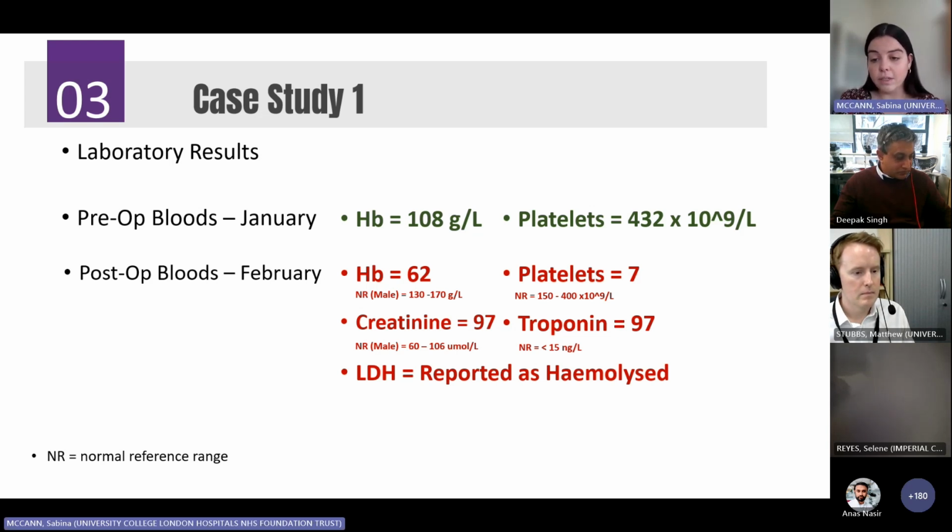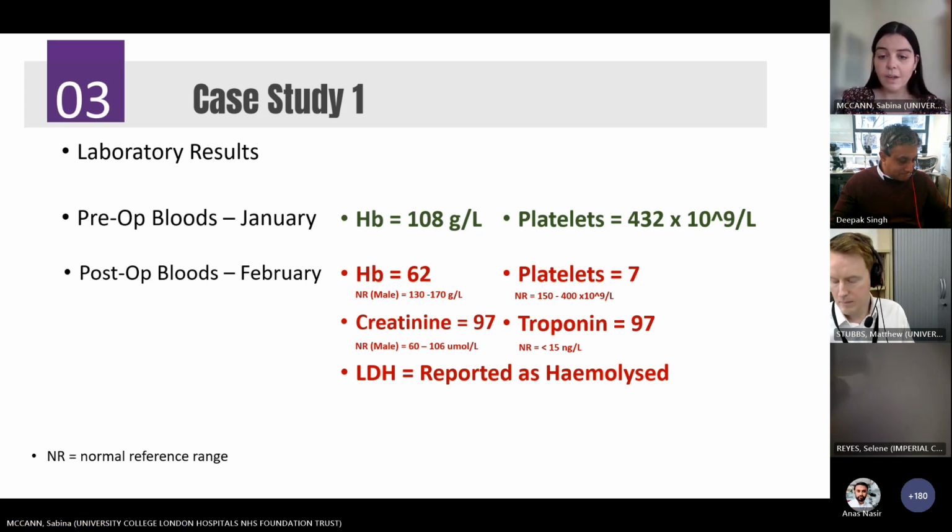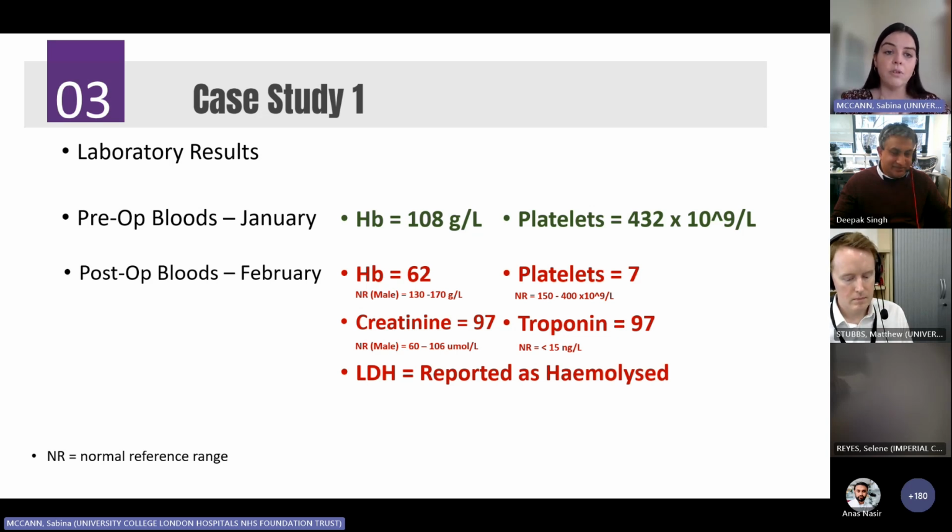So it's really encouraging to see that everyone has actioned all of the above urgently. I'm not sure of the percentage of the participants here today working in haematology labs, but from when I've worked in haematology, I know that MLAs, the BMS authorising, and the BMS reviewing the blood film all have an equal role in the positive outcome of these types of cases.